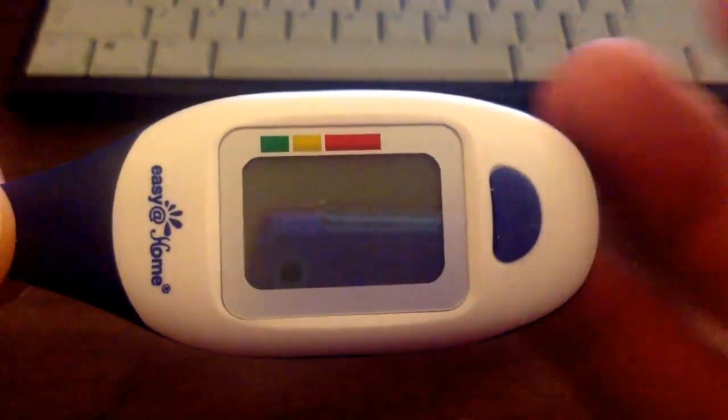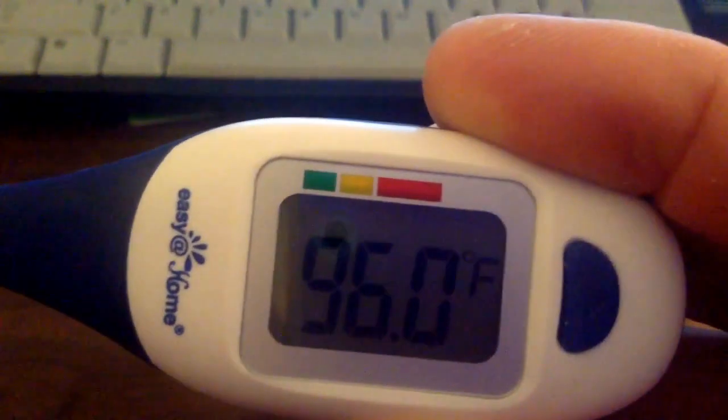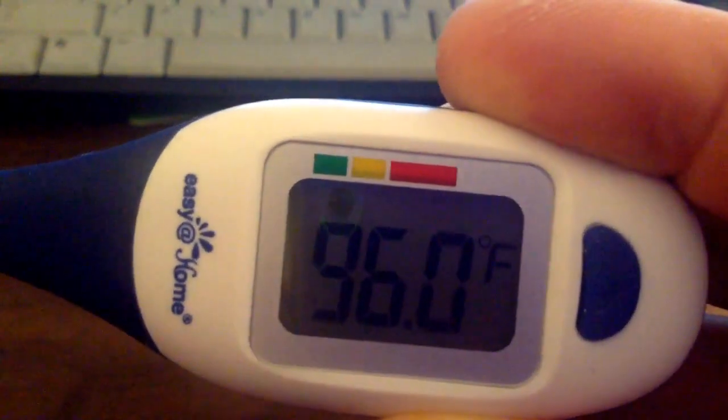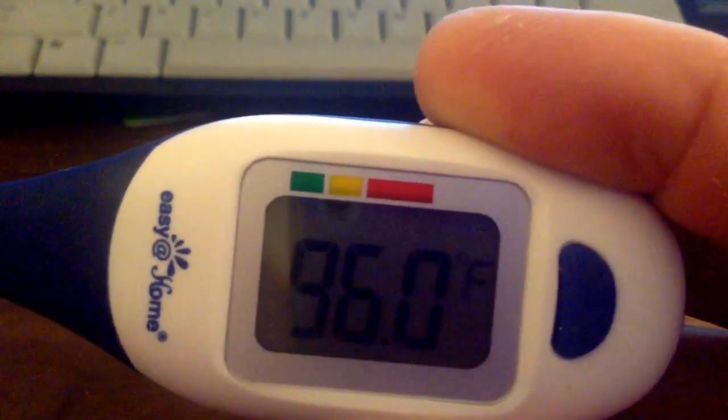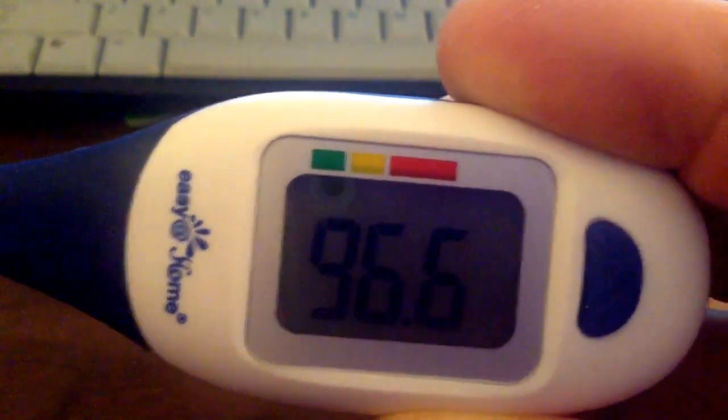The measuring time ranges between 10 and 30 seconds depending on where you use the thermometer. I noticed it takes longest in the armpit, but I got a fast response. The display emits a blue backlight and you hear a beeping sound to signal it is done reading.